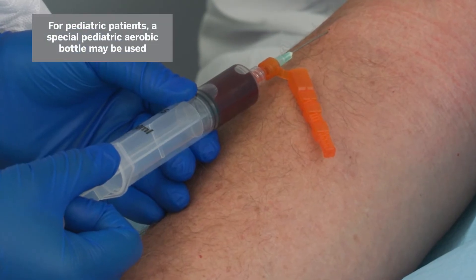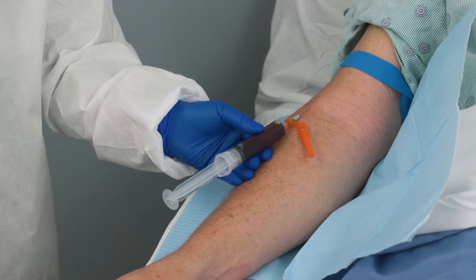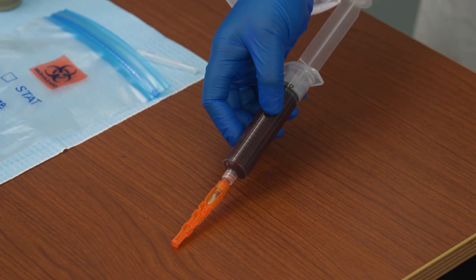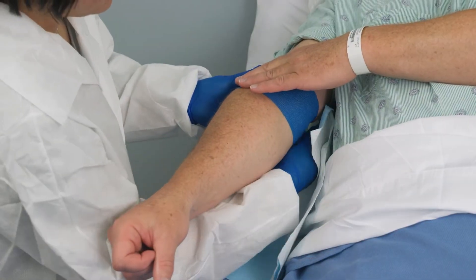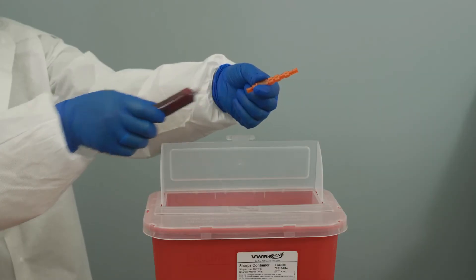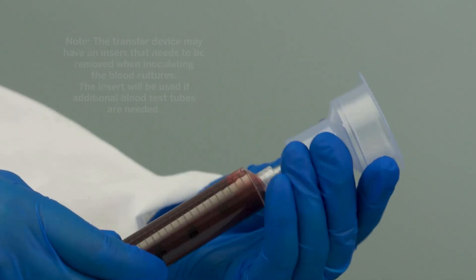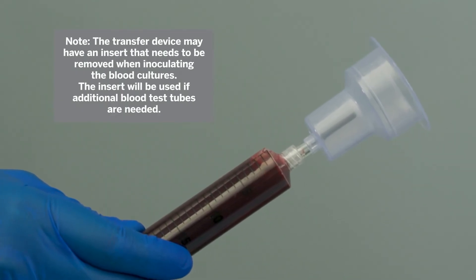For pediatric patients, a special pediatric aerobic bottle may be used and inoculated with up to 4 milliliters of blood. Remove the needle from the vein gently and engage the safety device. Cover the patient's puncture site with a suitable dressing and apply pressure. Discard the needle into a sharps container safely. Attach a safety transfer device to the syringe. Note, the transfer device may have an insert that needs to be removed when inoculating the blood cultures. The insert will be used if additional blood test tubes are needed.